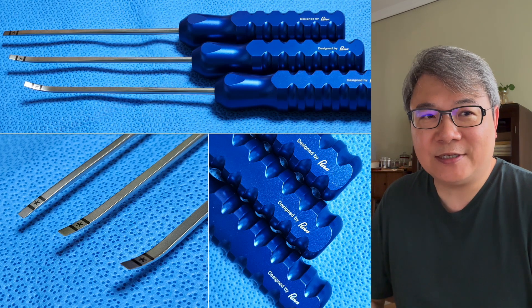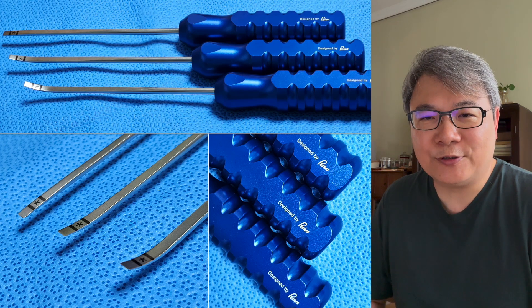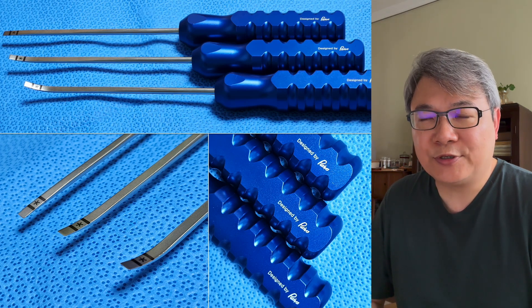I just received this instrument this week. I'm very happy to have the opportunity to use this instrument, and I'm going to share with you a case and how I use this osteotome to do the decompression.